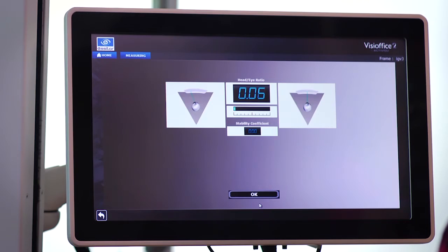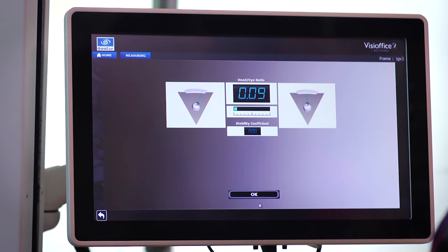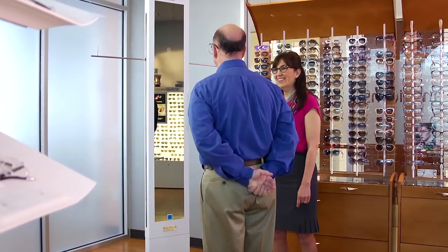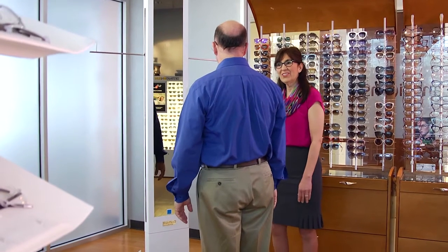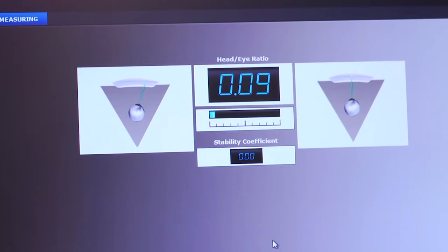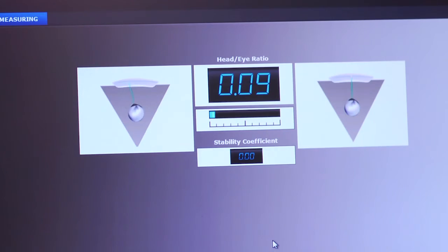For patients with an acceptable stability coefficient of less than 0.15, the system will display their head-eye ratio: less than 0.5 for eye movers, greater than 0.5 for head movers. The system shows the behavior they exhibit by animating one of two illustrations on the screen.